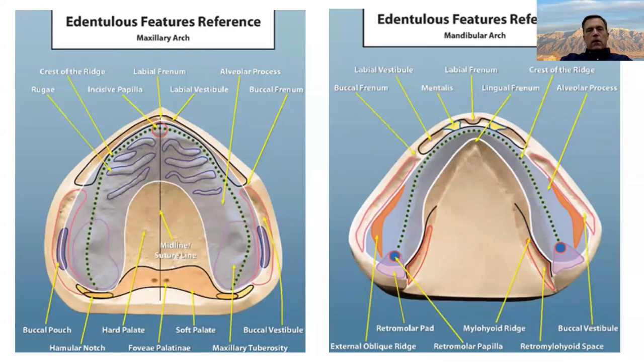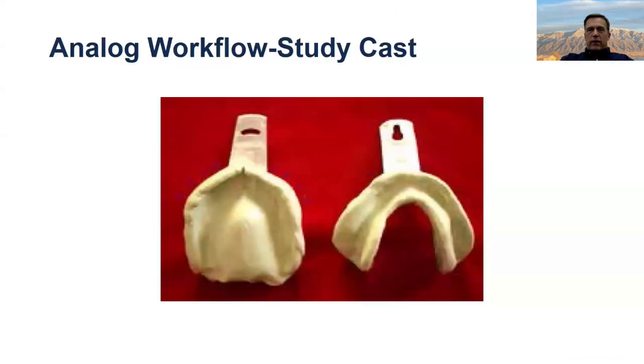So a special point of interest is the vibrating line. It can be difficult to see that on the model. So if you mark that on the palate and scan it with a color scan or texture scan, or take a physical impression and pick it up on the impression, that really helps, because a lot of times we're guesstimating that spot. And if we know exactly where it is, we can put our post-dam there if we decide we want one. You don't have to have one with digital dentures. And that way we'll make sure we get as much suction as we can for the case.